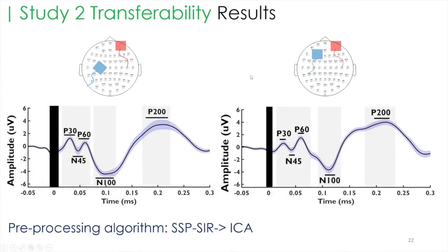Our results showed that we could recover, over both cortical regions, the known TEPs, early and late ones, using an advanced preprocessing algorithm that we developed.